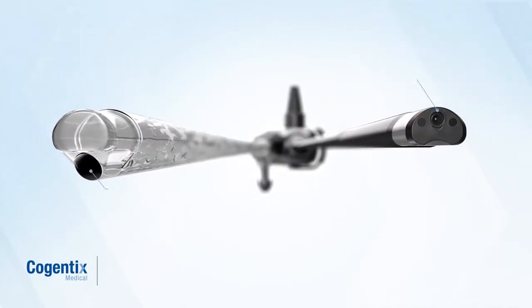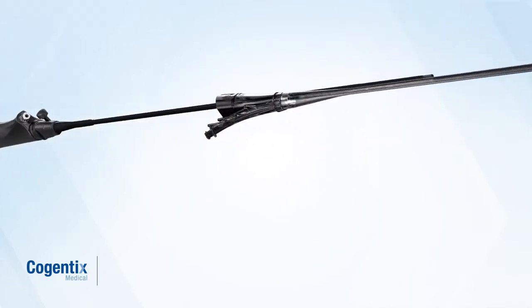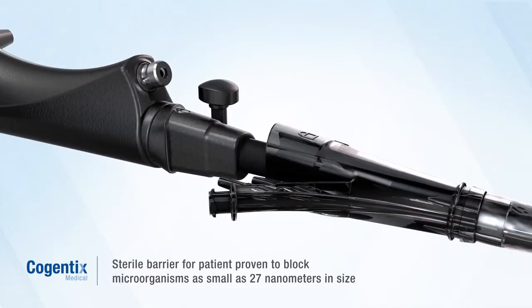Here's how it works. The working channel for irrigation, suction, and instrument passage is built into the sheath. The sheath fits snugly on the scope, providing a protective barrier proven to block microorganisms as small as 27 nanometers in size.